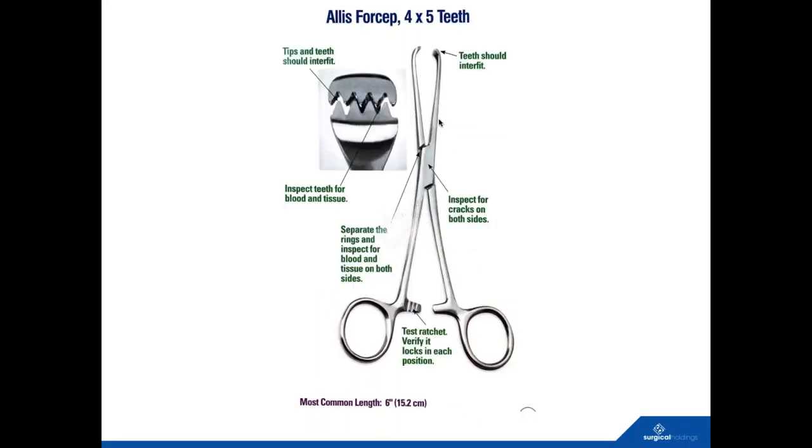Similarly with tissue forceps, so again, making sure the teeth mesh, and the device is smoothly operating.